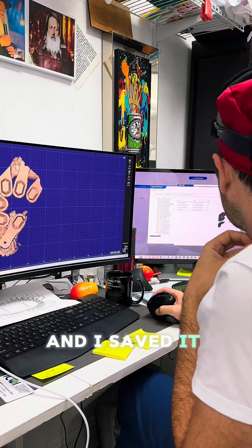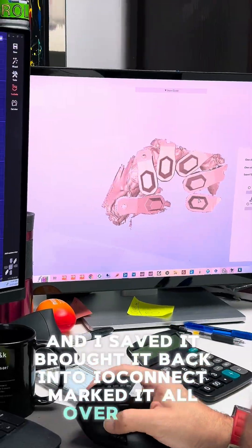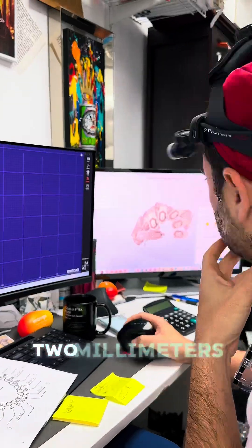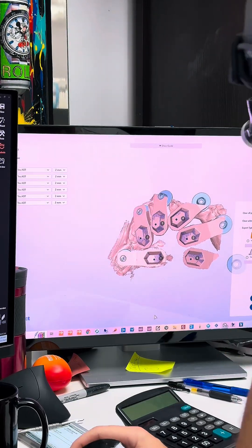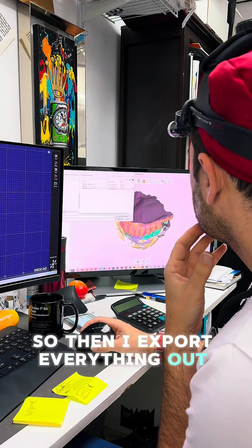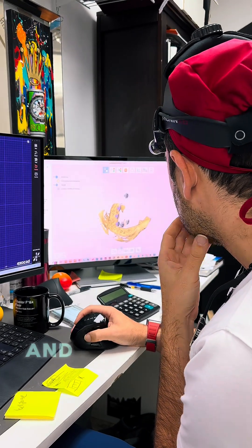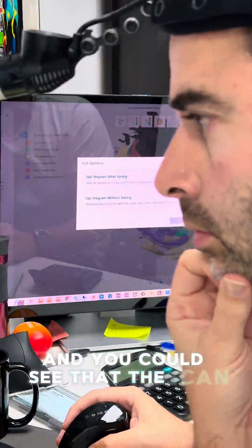I figured the system was getting confused by extra data, so I needed to delete that. I saved it, brought it back into IO Connect, marked it all over again - two millimeters - and within seven seconds it was done. I then exported everything out, realigned it with my soft tissue scan, and took a quick look at how it aligns beautifully. The scan is perfect.